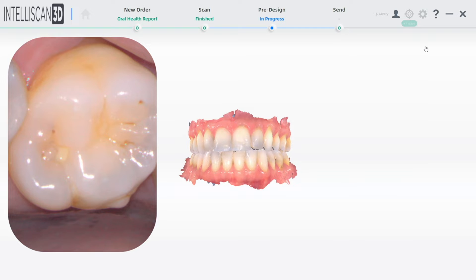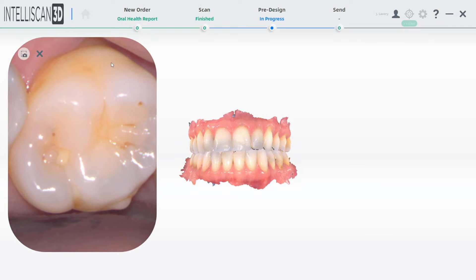This is revolutionary. When using this mode, it turns your Intelliscan Model X scanner into an intraoral camera.